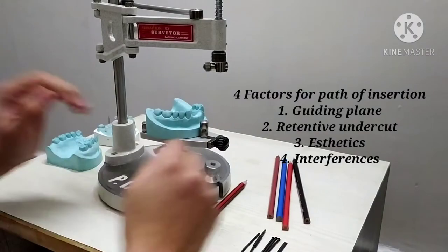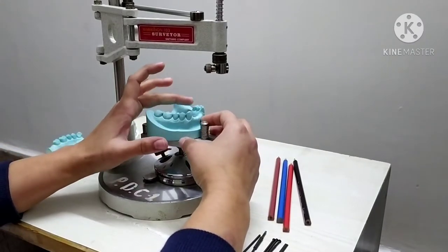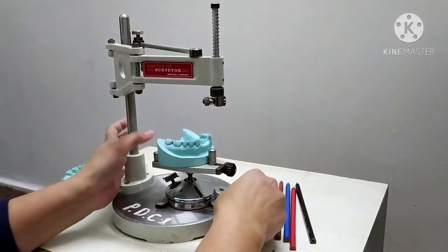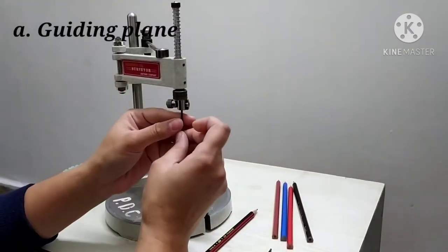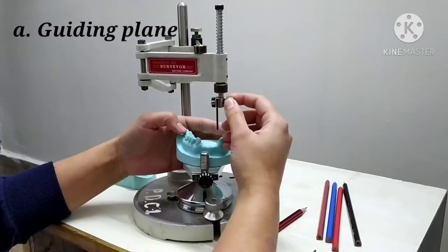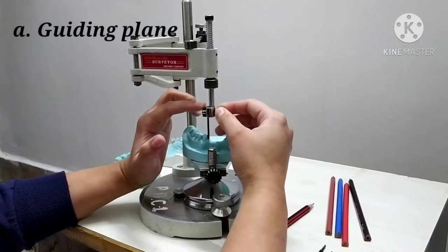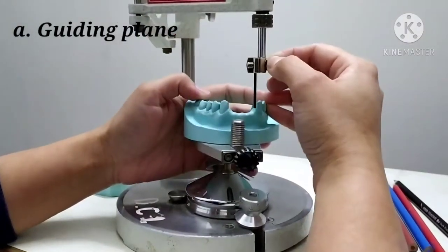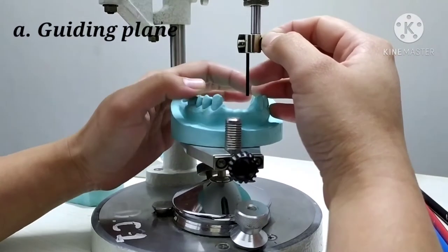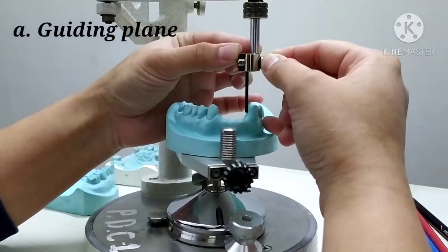Starting with the first factor — the guiding plane — it is determined by inserting an analyzing rod. The guiding plane refers to two parallel surfaces of teeth adjacent to the edentulous area. The guiding plane has to be determined at three areas: the proximal portion, the bracing arm, and the retentive area. For example, if determining the guiding plane for the mesial aspect of both canines, the guiding plane for the premolar must also be determined. If the analyzing rod is only touching the marginal ridge area of the premolar, the guiding plane is compromised on that premolar.